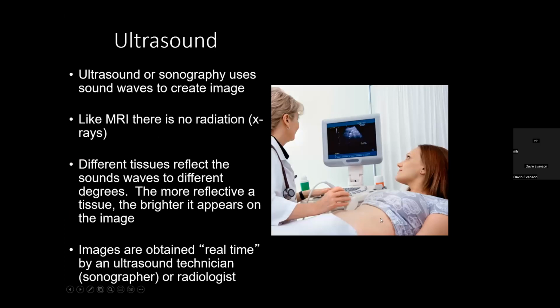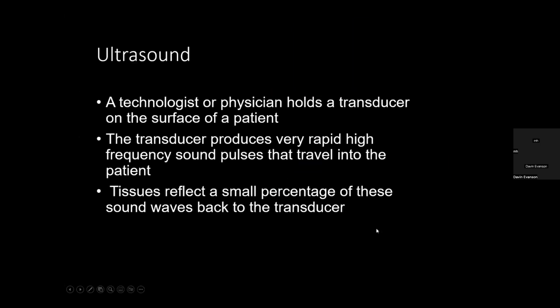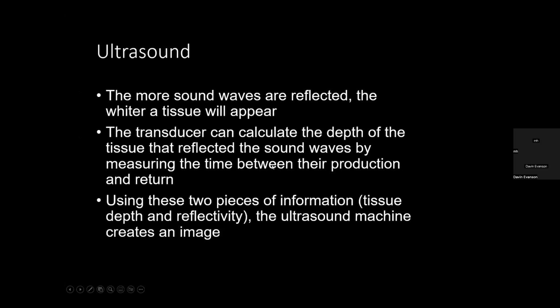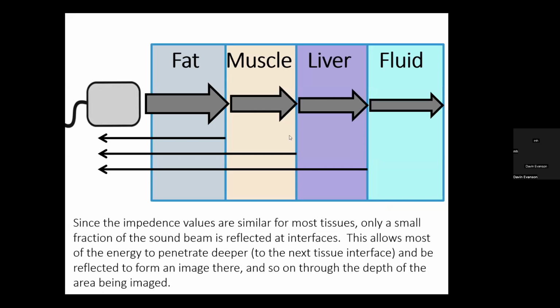Let's switch gears and talk about ultrasound, using sound waves to look inside the human body. Think of OB/GYN. We have some great modules on the building blocks for our future GYN docs and clerkships. There's a little baby inside. There's no radiation. Same with MRI. So anytime you have a pregnant patient, we love doing ultrasound or MRI. Lots of physics here. I'm going to go a little bit fast through this. Again, you can pause on this, but basically using the sound wave going through the patient, hitting different structures will determine if it's going to be bright, hyperechoic, or dark, anechoic, or somewhere in between.